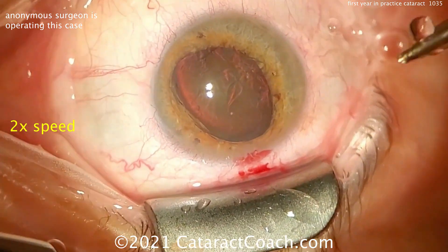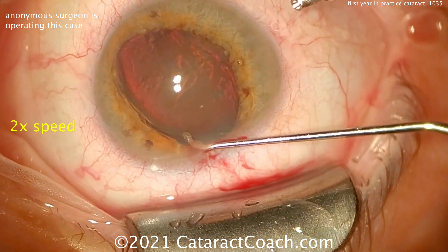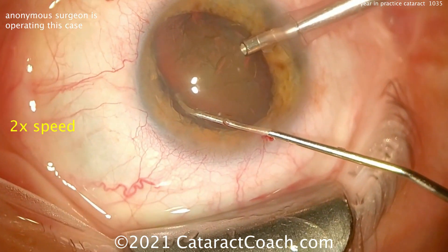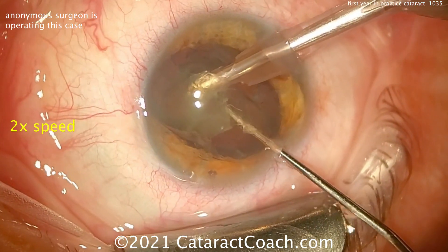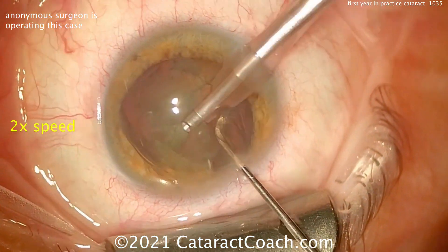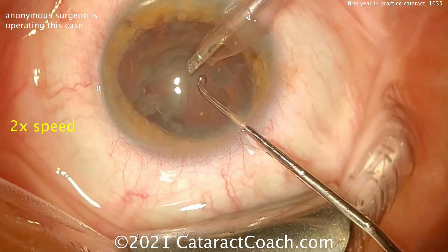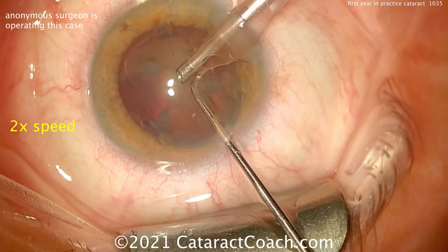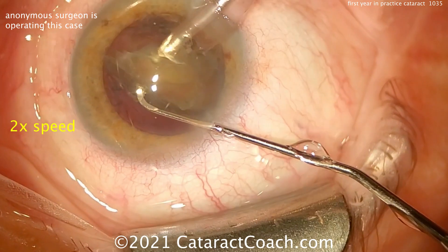Adjusting the phaco tip and phaco sleeve. And let's see the chopper going in the eye — not sure what model or design. It has that bulbous tip again — avoid that bulbous tip, that's just like using a butter knife to cut food. There's the split and it goes partially through but not fully. There was no good purchasing or holding of the nucleus with the probe, so the chopper was unable to really split the nucleus into two halves. So there's a partial split and the piece comes up — we'll give you a partial.